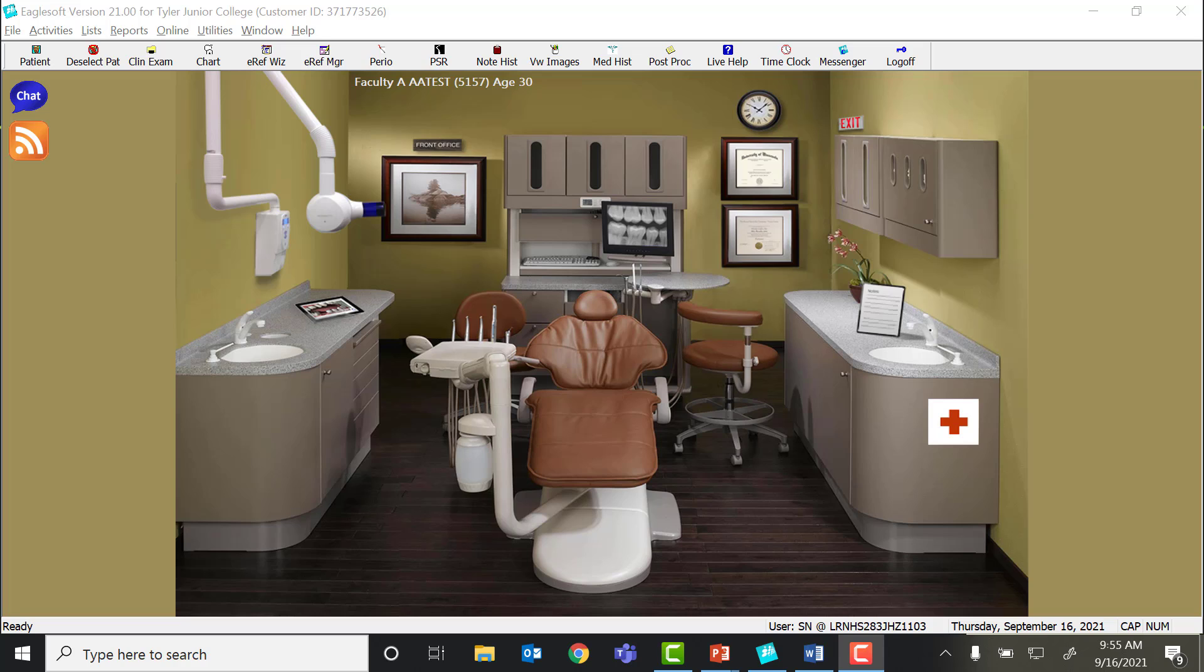You will either begin with your dental assessments beginning with x-rays or your periodontal assessment after your calculus classification has been done. So let's say you're going to start with perio.